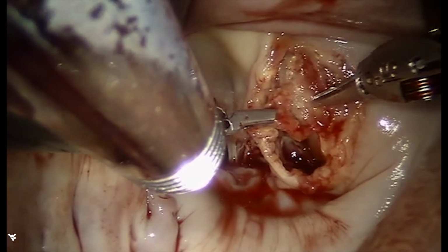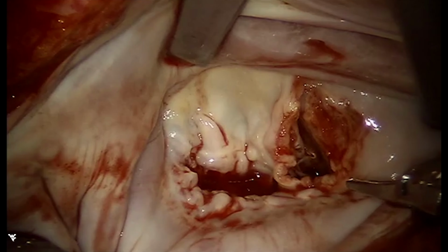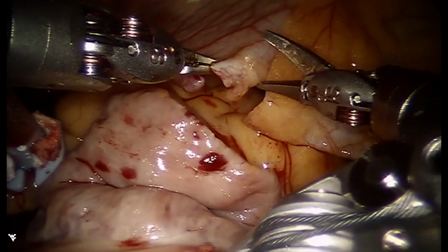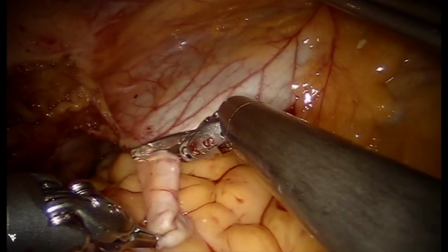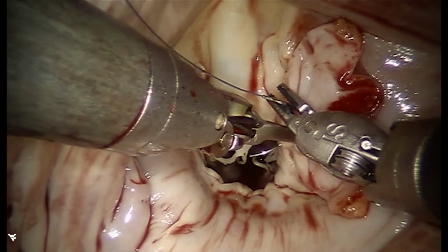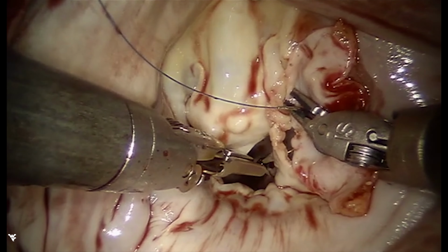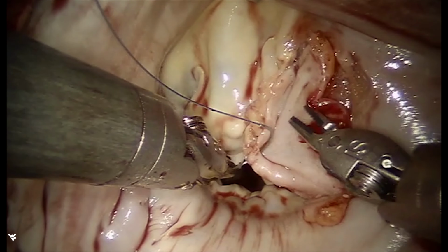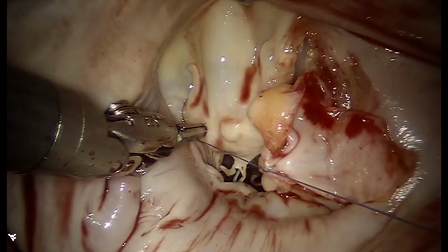The area is completely debrided, and note that we spent time to make sure that the leading edge of the commissure as well as P3 is preserved, and we can use this to repair the defect since this area is supported. So an onlay patch is then constructed.